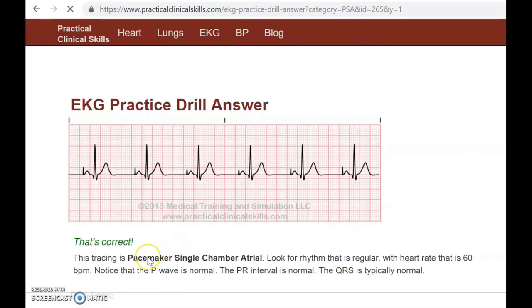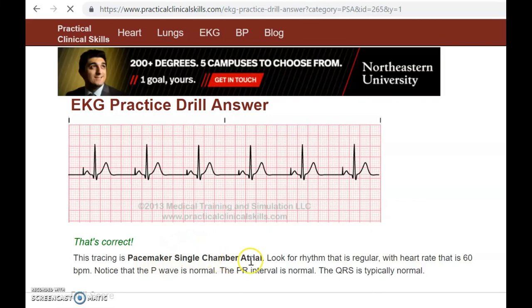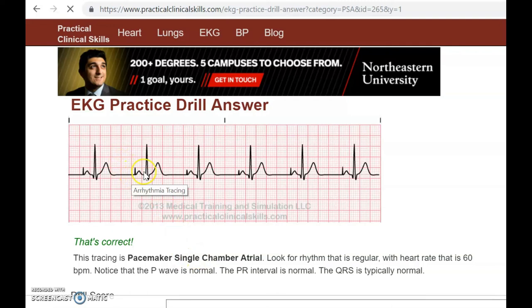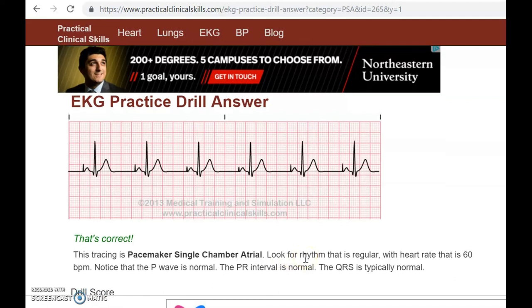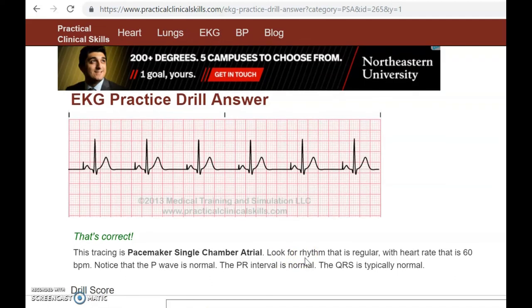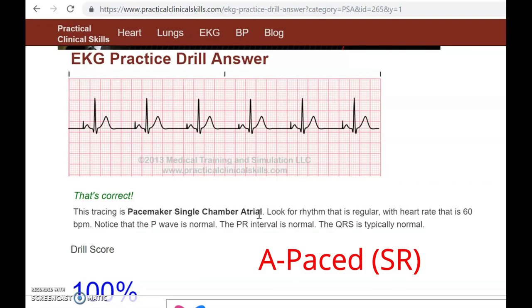This is correct — a pacemaker, single chamber atrial. When they say single chamber it means that if it were double chamber it would have two spikes; we have one spike, so it's a single chamber atrial pacemaker. The underlying rhythm is a sinus rhythm. When you have a pacemaker you want to also identify the underlying rhythm. On your rhythm strip you write 'pace' and in parentheses you write 'sinus rhythm' as the underlying rhythm. You don't always get an underlying rhythm with pacemakers because sometimes they just look so weird, and sometimes we only measure the QRS and the QT when there's no P wave present.